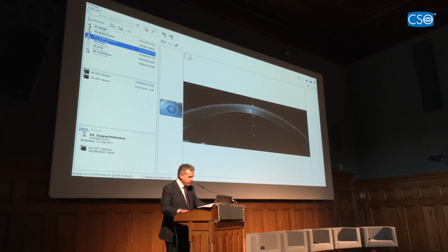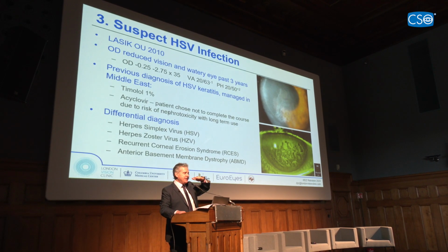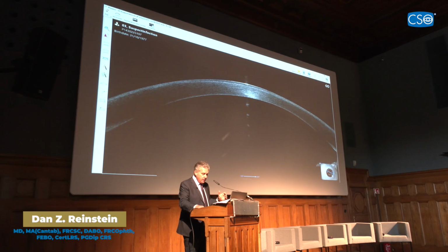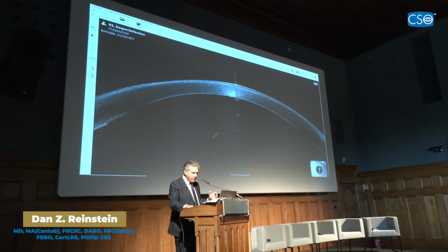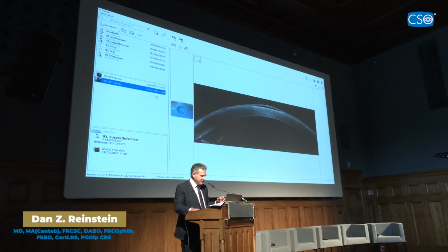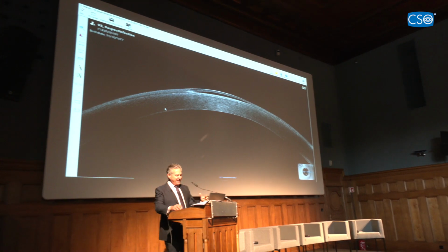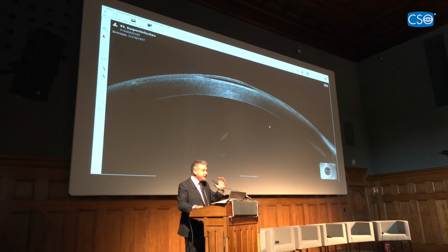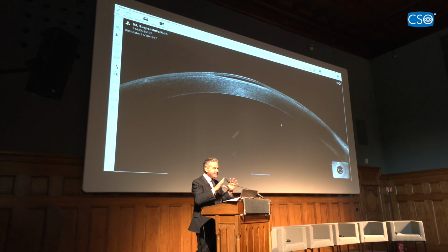And when you do that, quite simply, there's a mode where you can scan at 10-degree intervals for 360 degrees, right? All the way around. I'm just sort of rotating it rather quickly, but you can see. Oh, that's the post-op, sorry. I gave the punchline before the, I'm so bad at telling jokes, you know. So you can scroll through the different images, and this gave you instantaneous confidence in what was going on. Instantaneous.